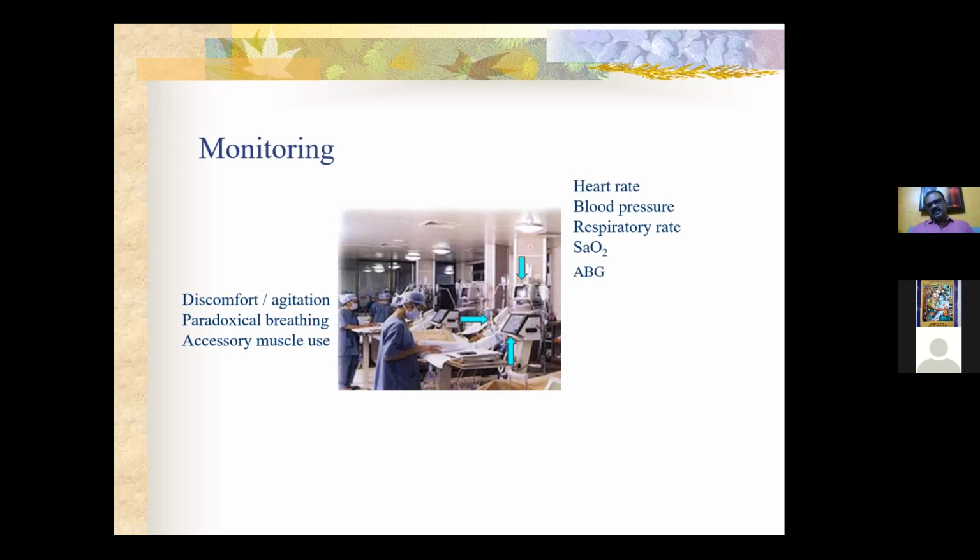Any change in all these things can point towards inadequate ventilator settings. If you don't change the ventilator settings, these things will persist, and you might get even a cardiac arrest. Then definitely monitor the alarms and ventilator settings. The usual thing that happens is when there is an alarm, we switch off the alarm or maybe give muscle relaxation and increase the sedation and keep the patient under. No, you should see what is happening and try to correct the causes. That is what alarms are for.